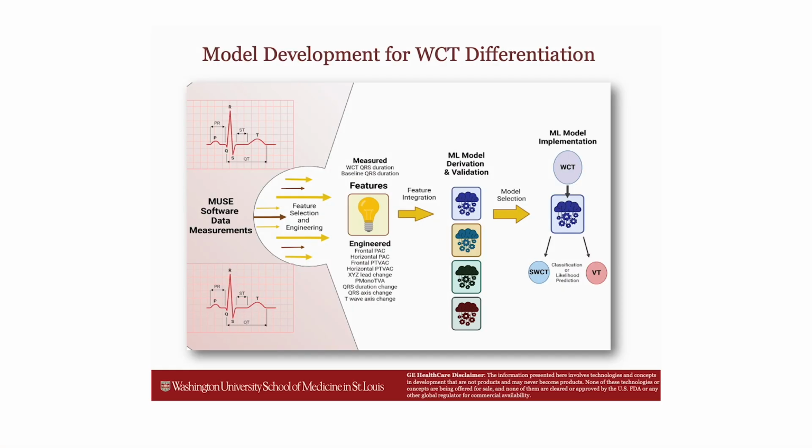So for model development, we started with MUSE software data measurements. We chose the measurements that we liked. We developed the features that we liked. We put these features into machine learning model architectures, and then we ultimately selected the best performing models for implementation.